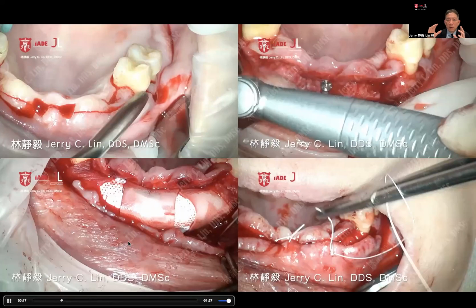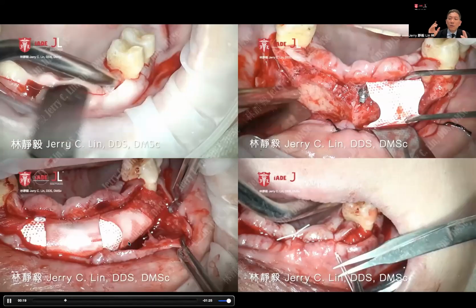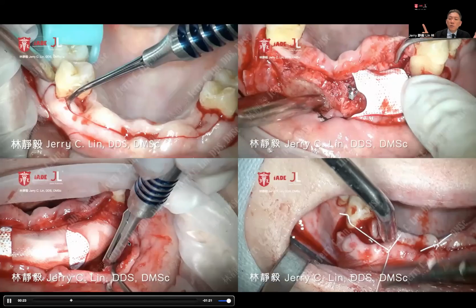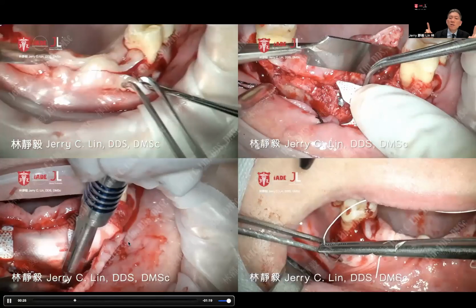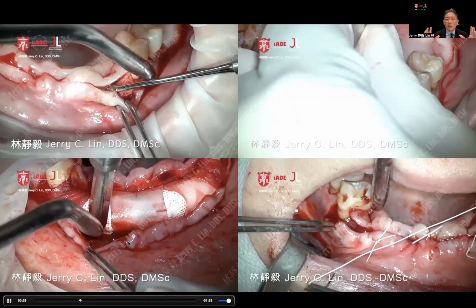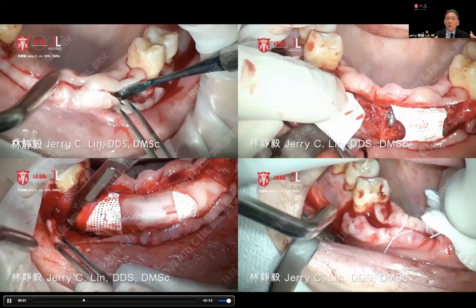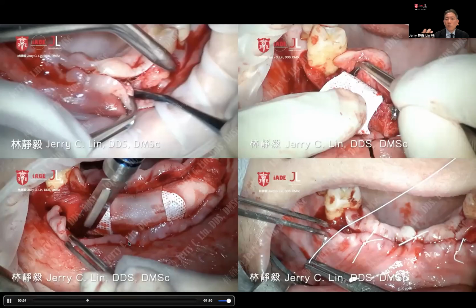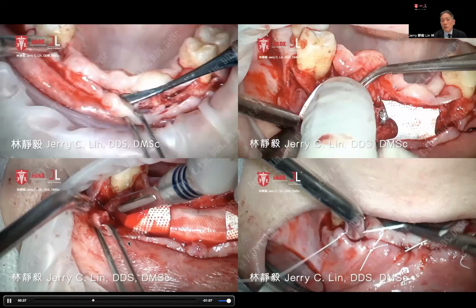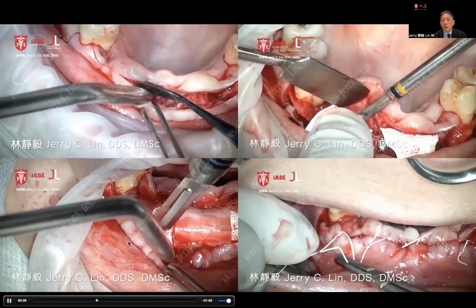They worked together because I have to treat the perio problem of 2 premolars for periodontal regeneration, keep the space for aesthetics, and build up the bone for implants and also for aesthetics as well. So this is a very difficult scenario that we're looking at.